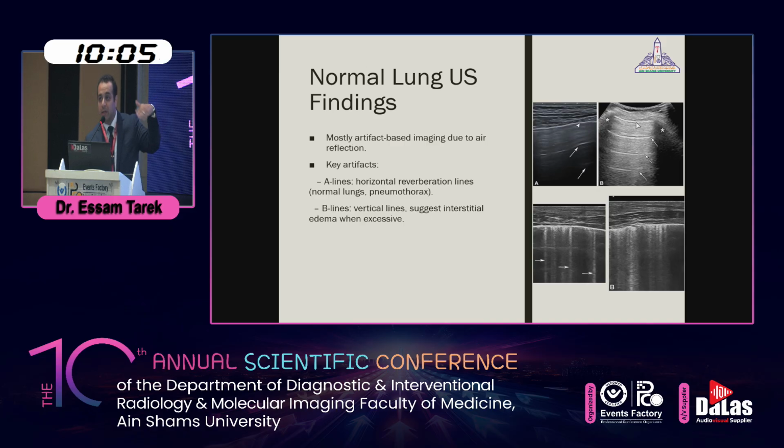All this is normal, it's an A line, meaning there is air inside the lung. So it's the normal finding, or maybe in a pneumothorax we have a lot of air, so that also will be found as an A line.